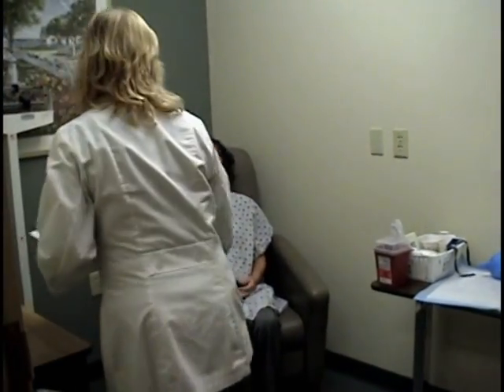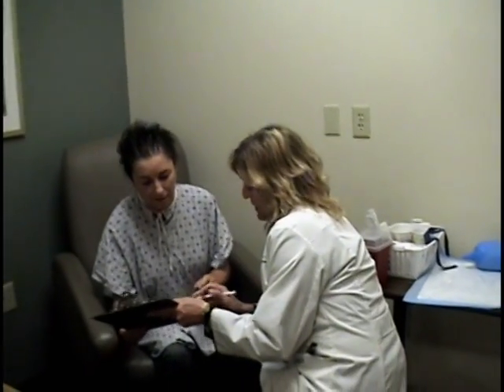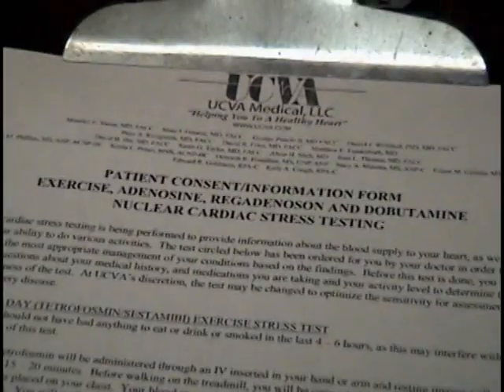Before we begin we will explain the exam to you. Please do not hesitate to ask any questions. Once your questions have been answered we will require that you sign a consent form.